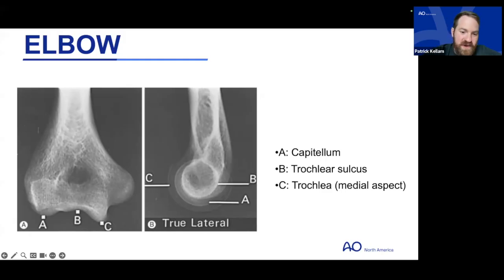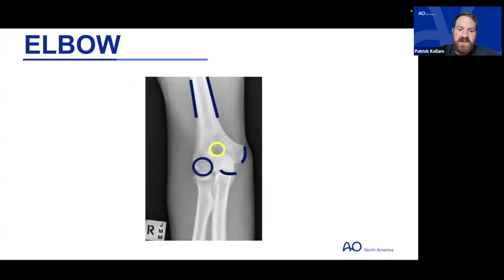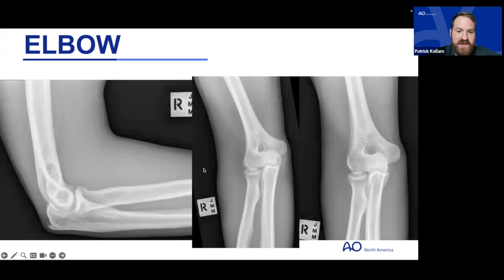And I think we'd be remiss to say, if you can go back a slide, that the radial head and the proximal radius should always point towards the capitellum. There's a fracture called a Monteggia fracture, which is a proximal ulna fracture, where the radial head dislocates. And so whenever you look at an elbow, one thing you should always do, there are many things, but the one thing you should always do is make sure the radial head is located. And it should always, no matter what image, it can be the worst quality, worst positioned film, it should always point at the capitellum.